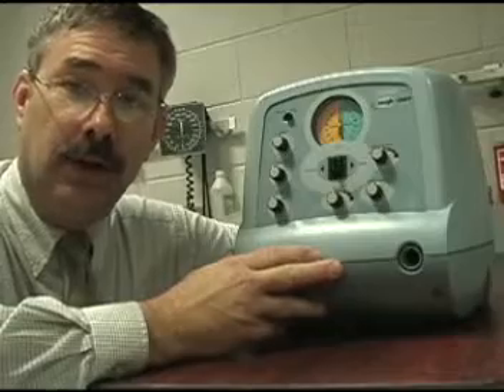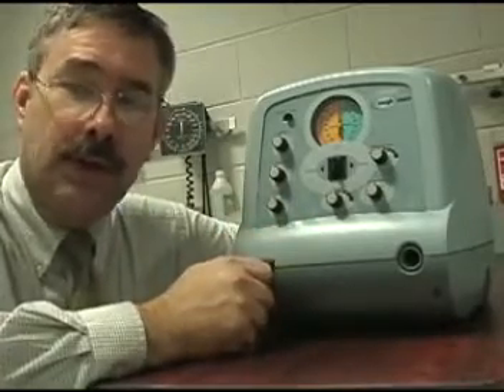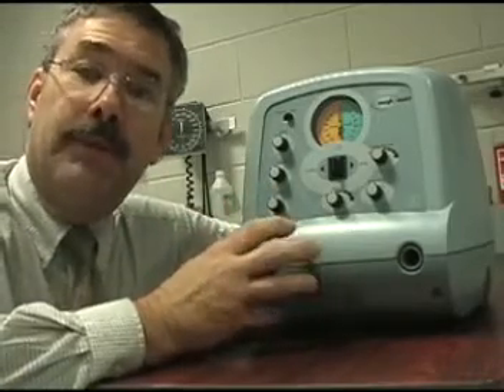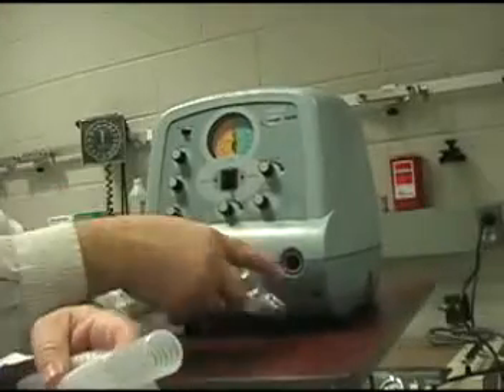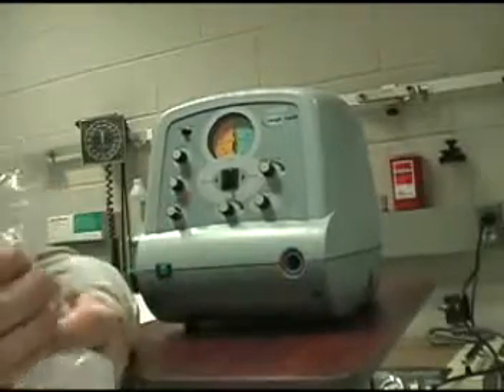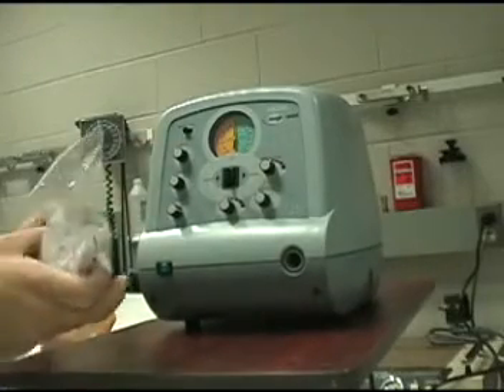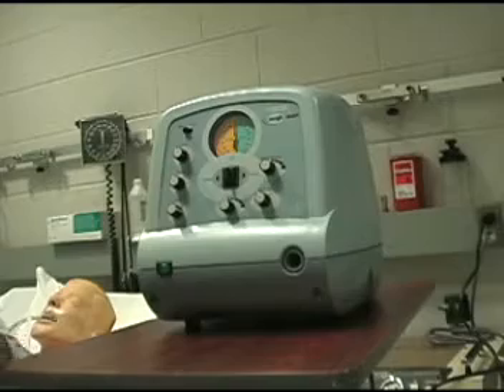That's this machine here. As we go through the Cough Assist, I think you'll find it is fairly interesting but a very easy machine to utilize. You should never use this machine without one of these — an exhalation filter or a bacterial filter. That simply fits on to the front of the machine.